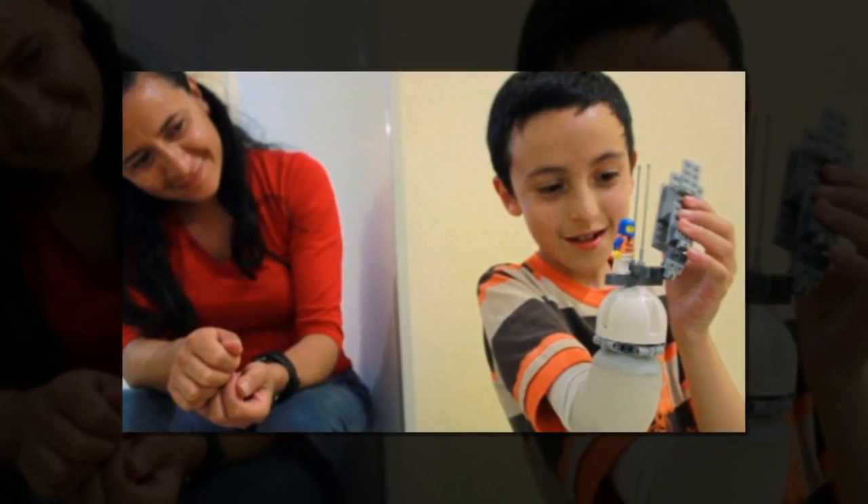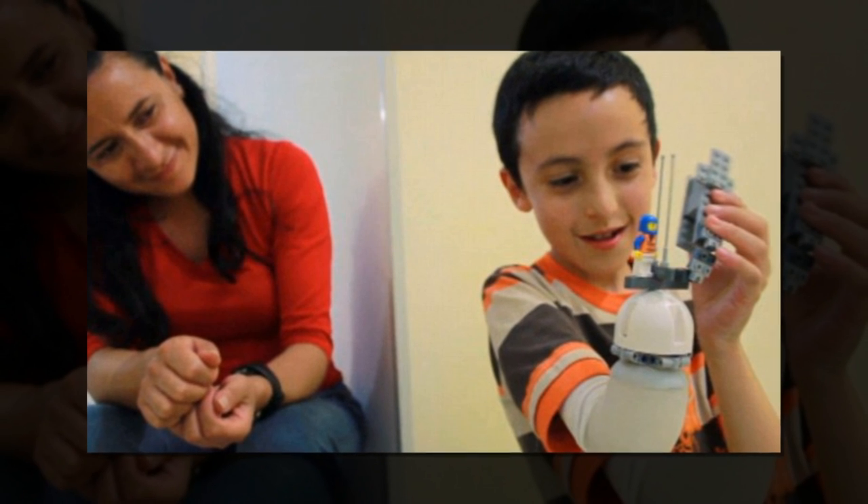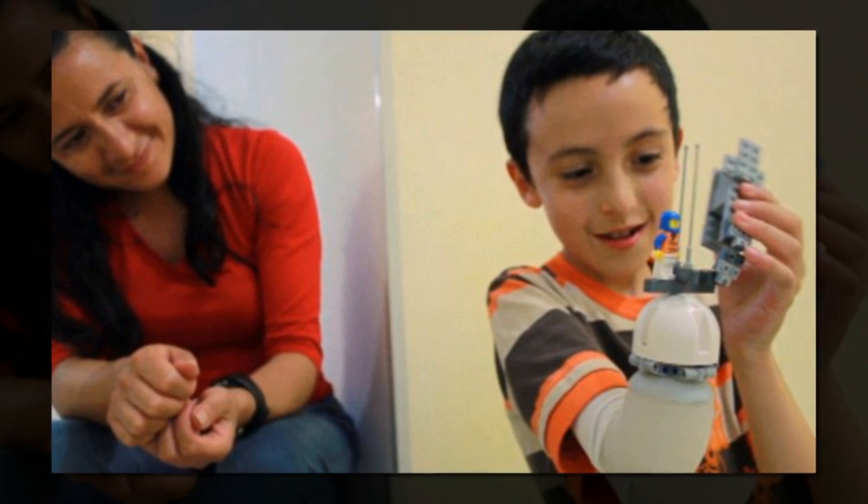My idea was not to make a traditional prosthetic, but to propose a system that was flexible enough for kids to use, hack, and create with by themselves and with their friends.